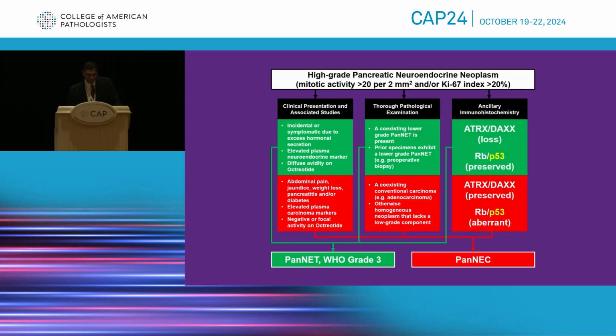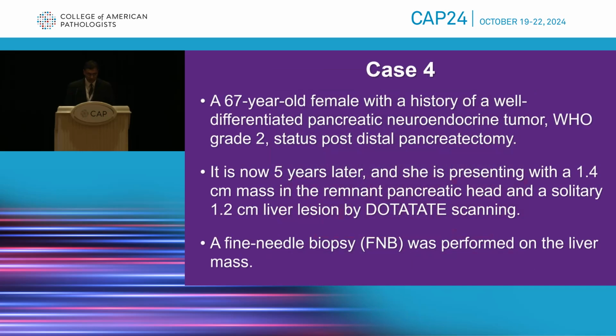And finally, as I reviewed, I find that a limited immunohistochemical panel can be very invaluable in dealing with these types of lesions, consisting of ATRX, DAXX, RB, and then again, cautiously P53. You'll see that P53 in the literature can be used, at least in the right context. If you certainly see ATRX or DAXX loss and you see loss of P53 or aberrant expression of P53, follow that ATRX and DAXX. Those are going to be your better markers. Same goes with the RB as well.